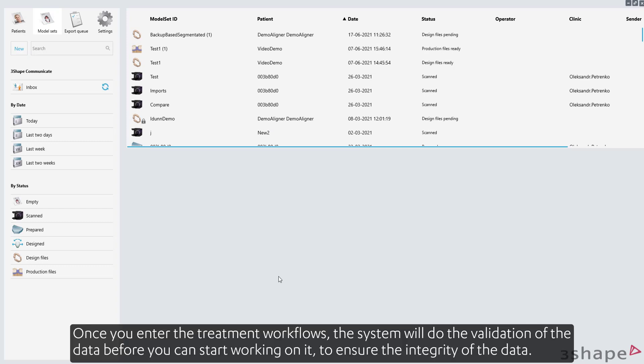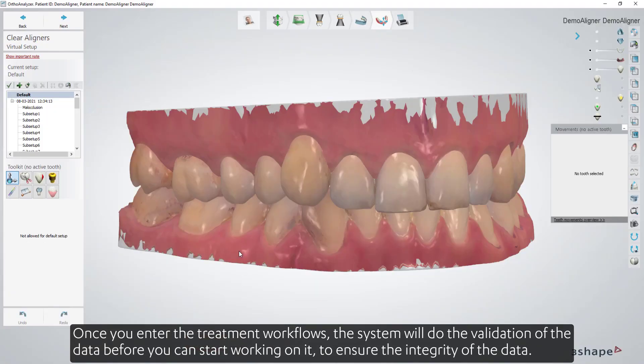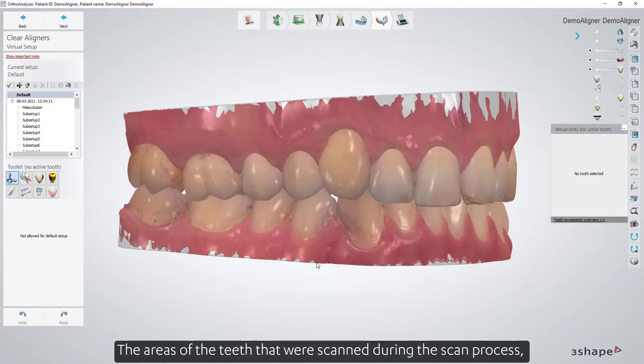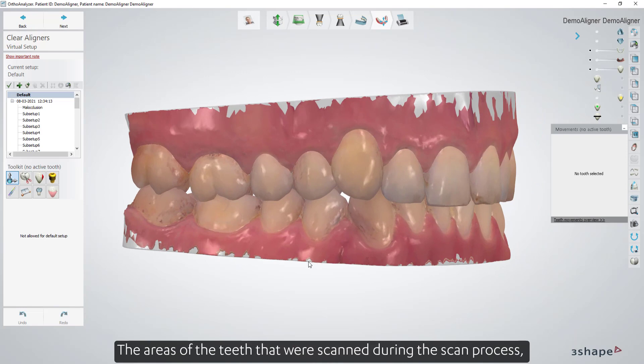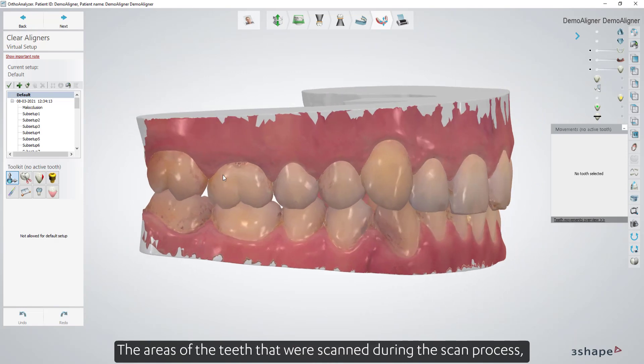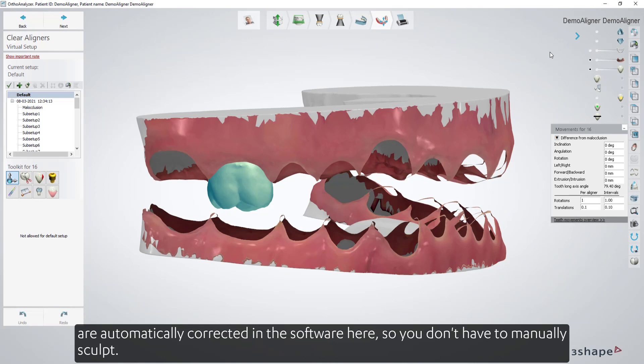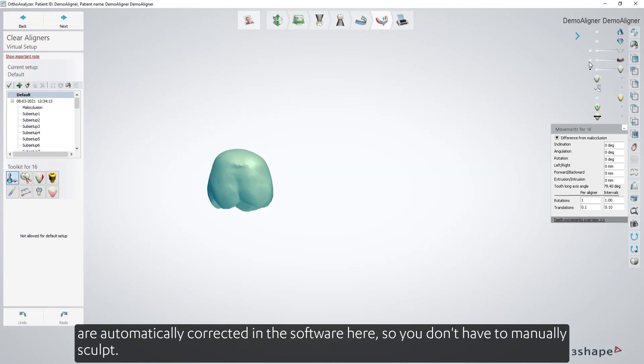Once you enter the treatment workflows, the system will do the validation of the data before you can start working on it to ensure the integrity of the data. The areas of the teeth that were scanned during the scan process are automatically corrected in the software, so you don't have to manually sculpt.